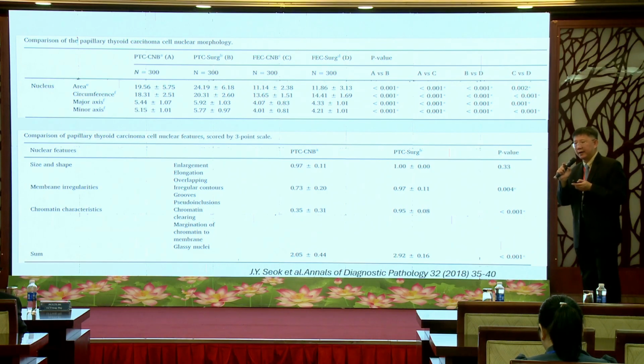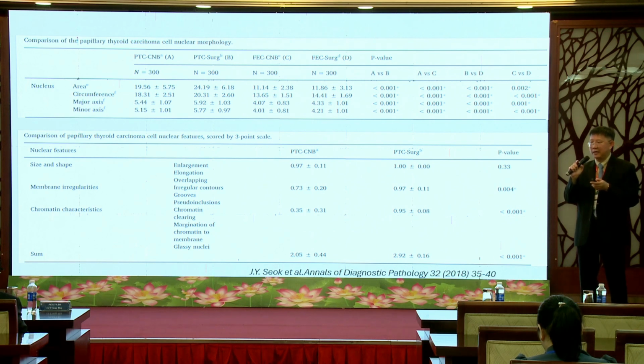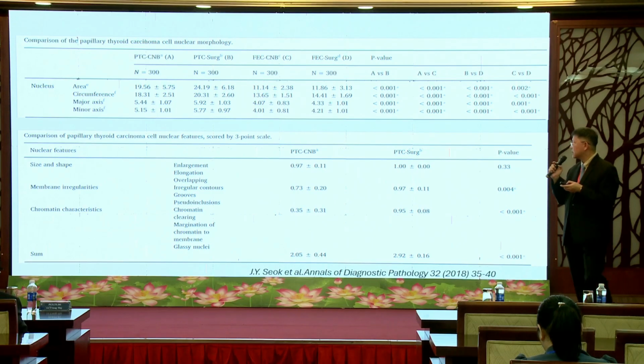So this is, I think, about the process. It comes from the process of preparation. So this is another pitfall, especially when you have a small core biopsy and you don't have a benign cell to compare, like this case. You can be confused with a benign lesion. So be careful.